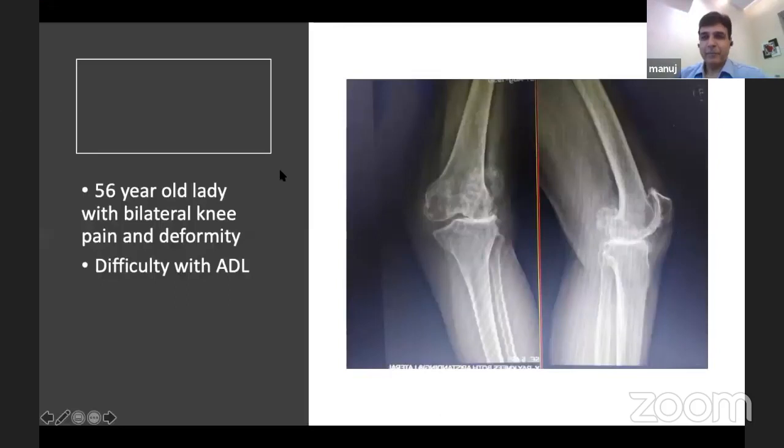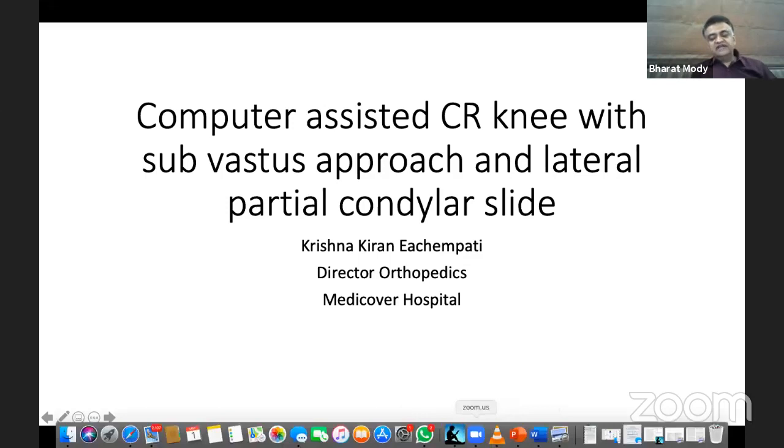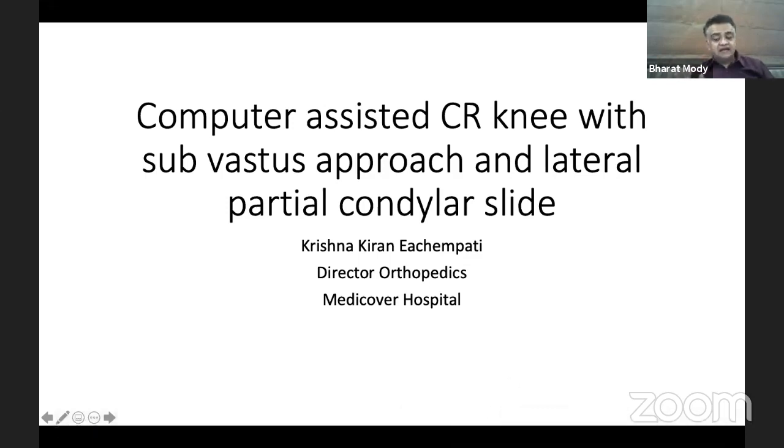Dr. Mohanty, I think starting. That's a good thing that we always keep constrained implants on standby on the table. But once preoperatively, if you have evaluated, just a moment. It's not a question of having an implant on table. It's a question of deciding whether in times to come, your non-hinge implant will still be able to hold that hyperextension from recurring as a result of a background neuropathic element, because hyperextension does not all that frequently happen just from bone loss.